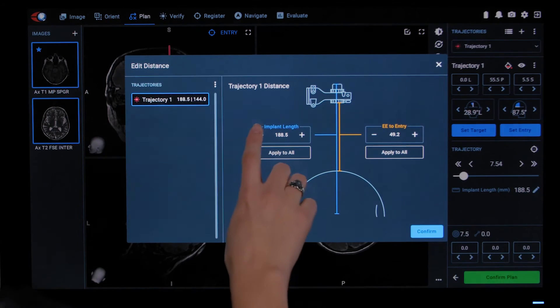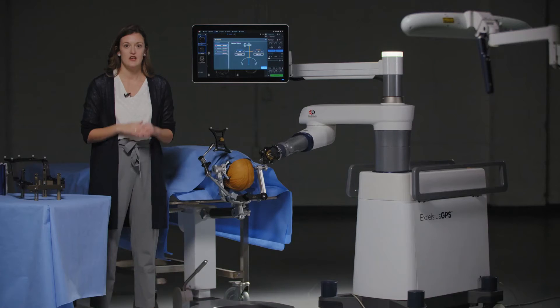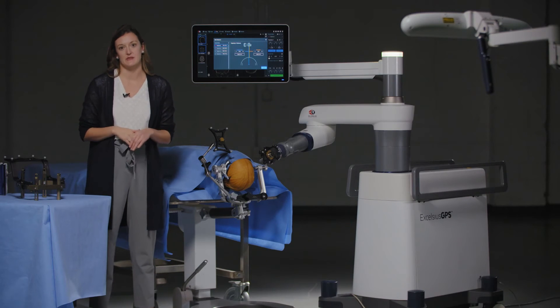By clicking the edit icon, you can set your implant length or your end effector to entry length for each trajectory to automatically set the height of the robotic arm for implant placement.